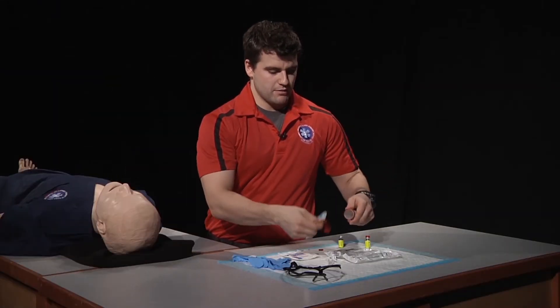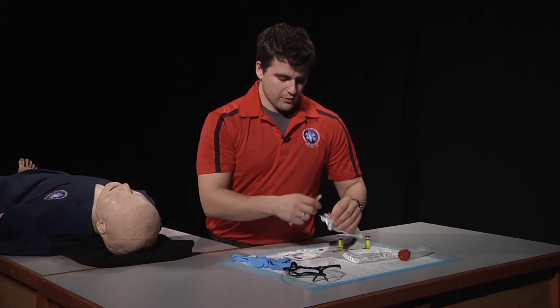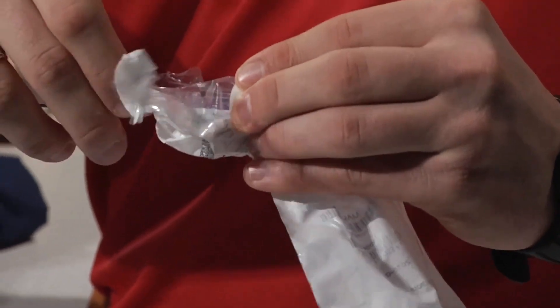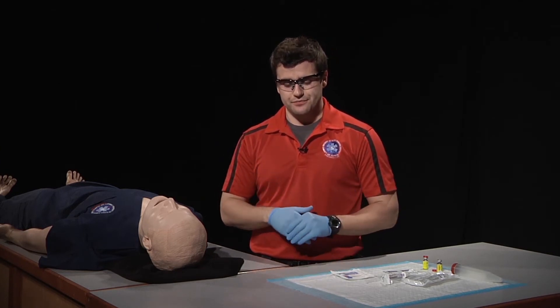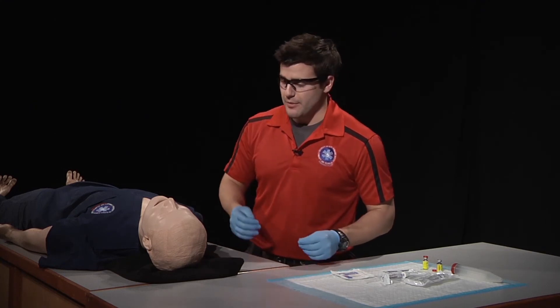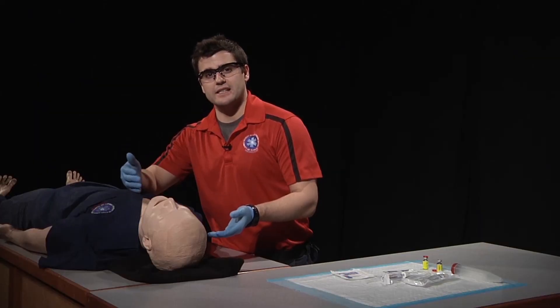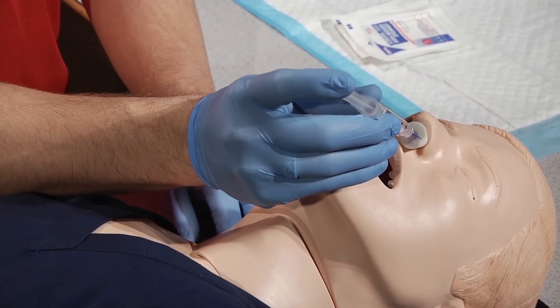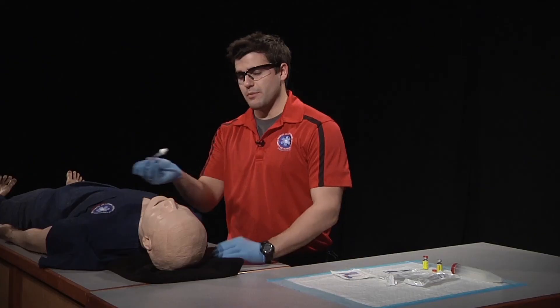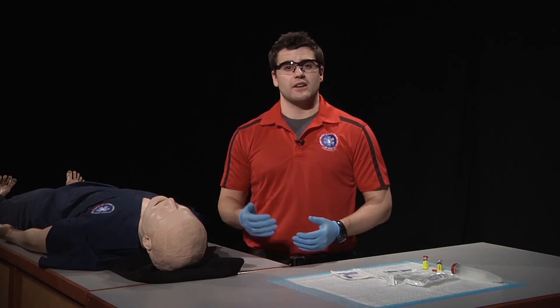We will then immediately sharps the needle and reattach our syringe to our mucosal atomizing device, also called a MAD. After applying the appropriate PPE — in this case eye protection and gloves — we're going to direct the partner to cease ventilations. From there, we're going to inspect the nostrils, looking for the larger of the two, as well as the one that is least deviated and least obstructed. Once we've found that, we're going to insert the MAD into the nostril and briskly depress the syringe plunger. From there, we will dispose of the MAD appropriately, begin ventilations if necessary, and observe our patient for the desired and adverse effects.